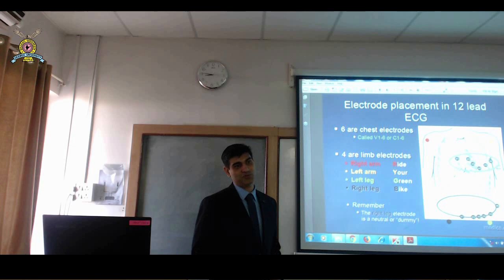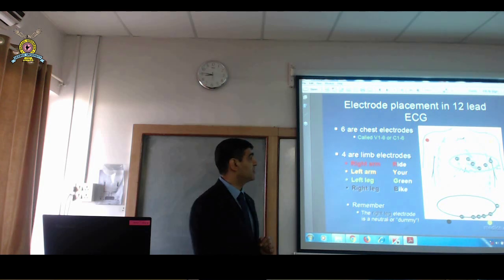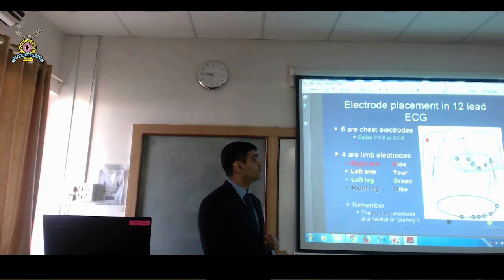Again, nipple position can vary. You can have multiple nipples too. Right? Have you seen somebody with multiple nipples? No? Yeah? So there's a mammary line and you may get patients with 4 or 5 nipples. So nipple is not a landmark. So your landmark is fifth intercostal space and mid-clavicular line.